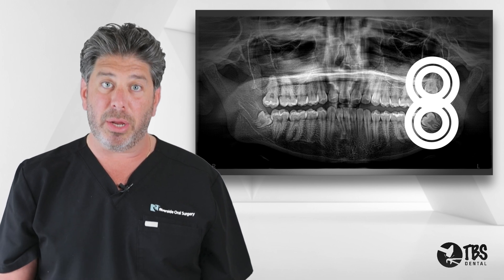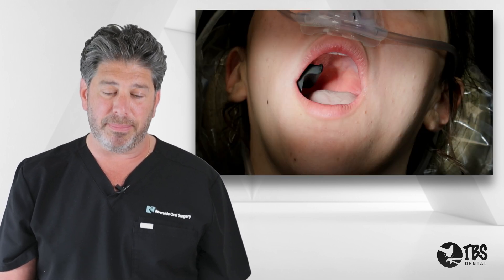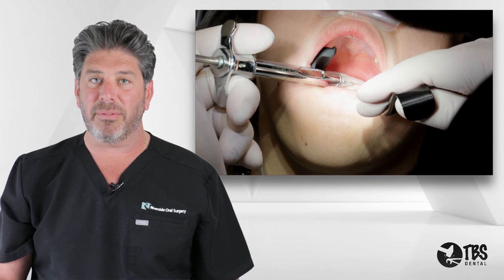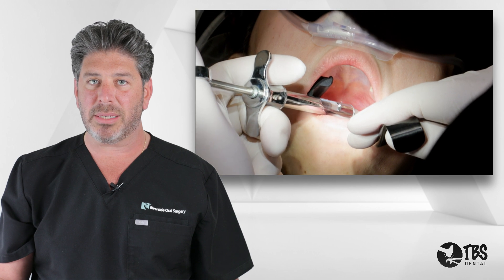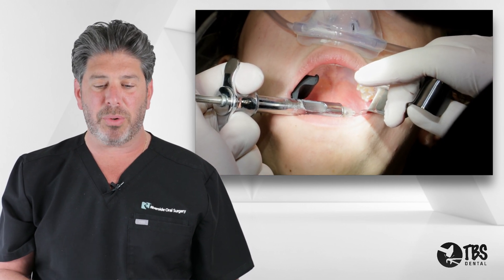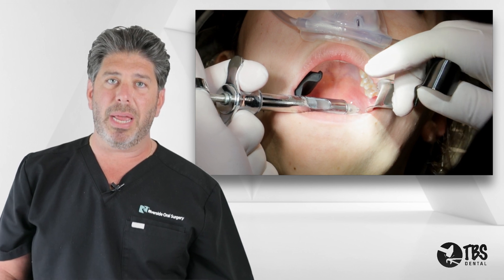We'll complete this case pretty quickly and uneventfully for the patient. First we go in after the patient is sedated to the appropriate level and give local anesthesia. We give blocks to the lower, then move on the same side to the upper and infiltrate.